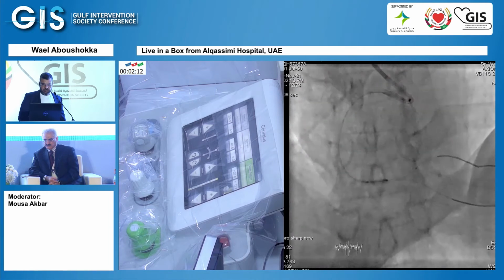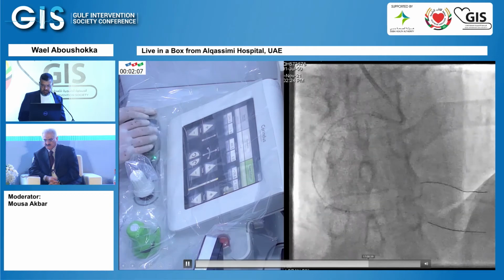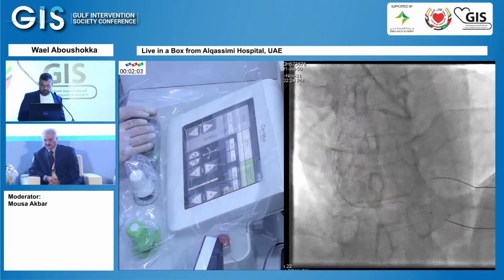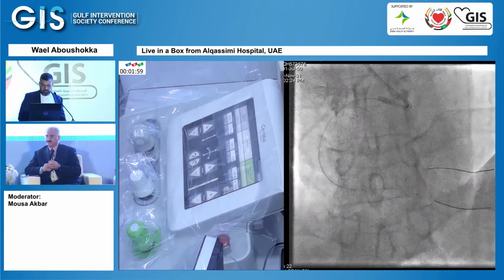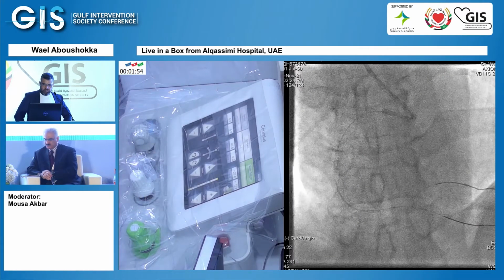Down. Okay, so that's the real measurement of the length of the lesion. So you can set either the distal or the proximal dot of the balloon and reset your distance.